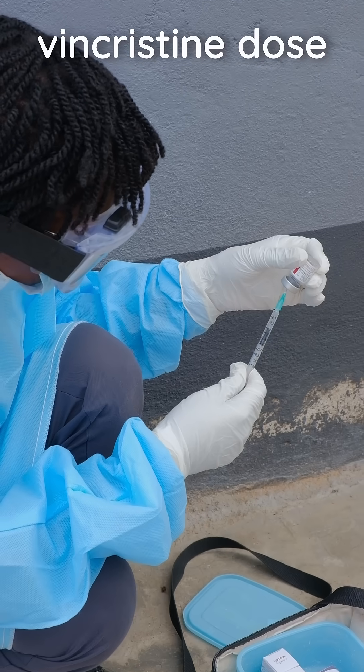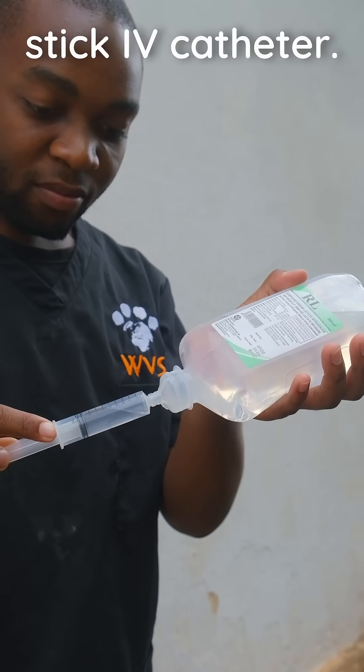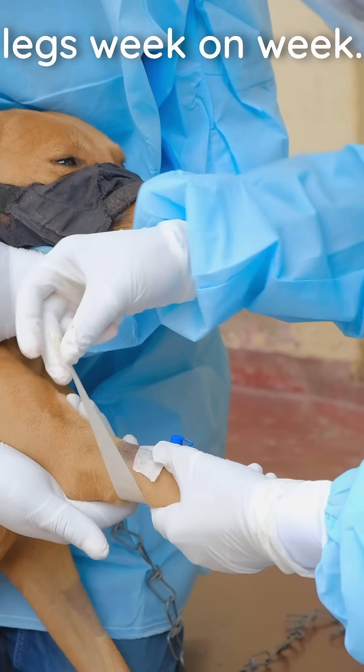Prepare your calculated vincristine dose as well as 10ml of sterile flush in a separate syringe. Then place a clean stick IV catheter. This must enter the vein cleanly on the first attempt to prevent extravasation of vincristine. Use alternate legs week on week.